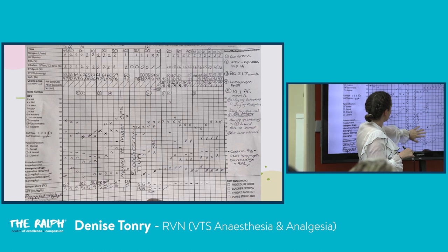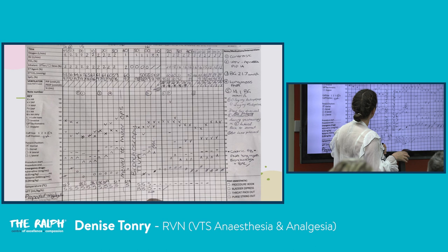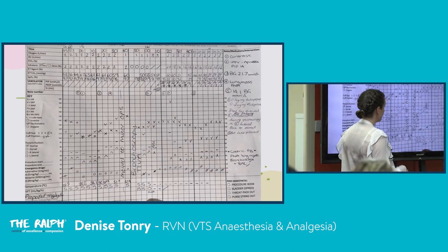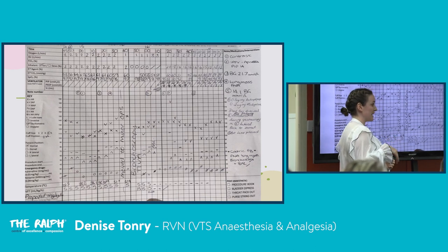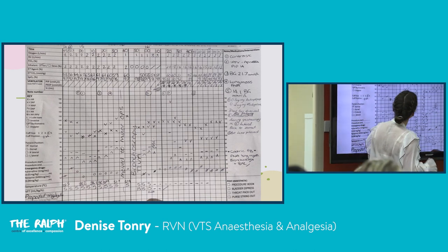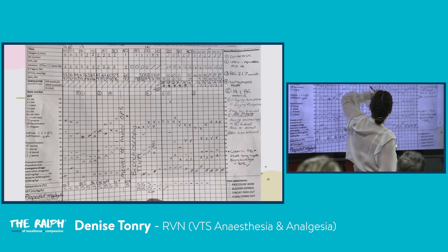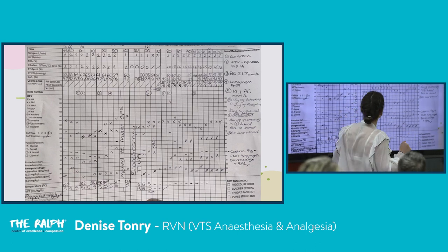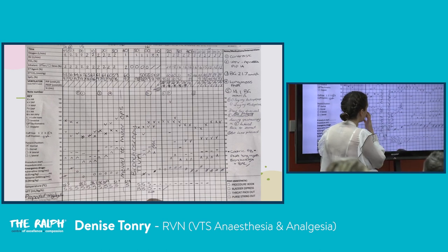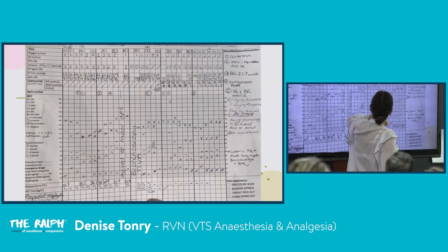We moved to minor ops and did a bronchoscopy. Again, we're in sternal, so we're tolerating this very well. Incidentally, we found a foreign body in the abdomen, so they wanted to rotate this patient into lateral recumbency and do a gastroscopy. When I flipped her into lateral recumbency, we had this decrease in SpO2. I did all my usual things: wet the tongue, check for equipment malfunction. And again here, I'm dropping to 88 and that's a bit unsettling.